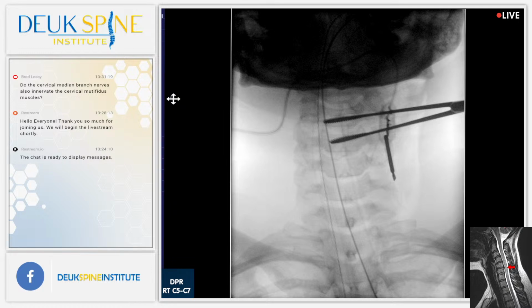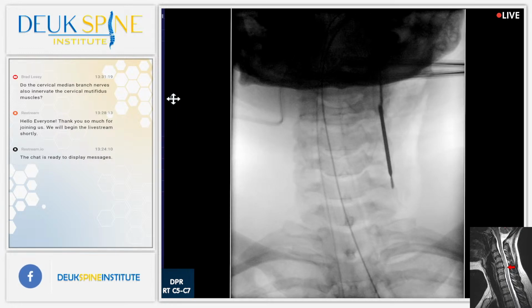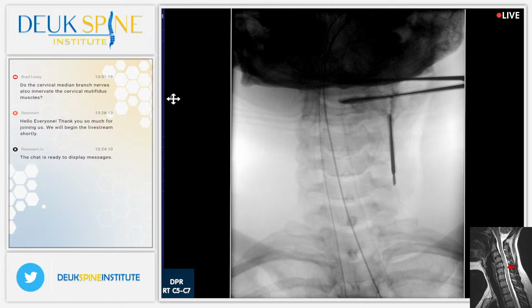Her facet joints are pretty clean. However, they are very painful, and she has horrible pain with rotation. So she's an interesting case. She's young, very healthy, but she does not have much of the bone spurs that we typically see with this condition. Probably because she is so young. And the injury is more recent. Shot?